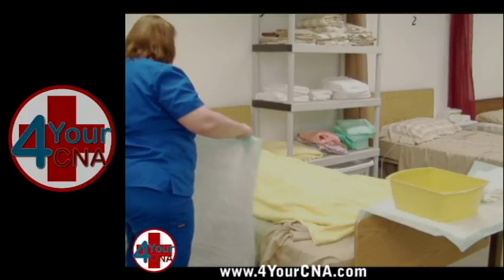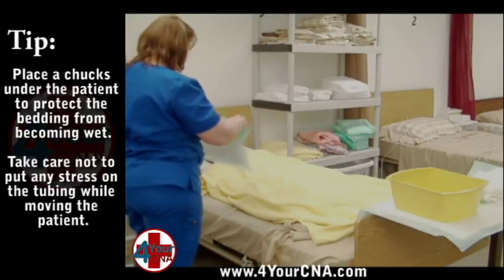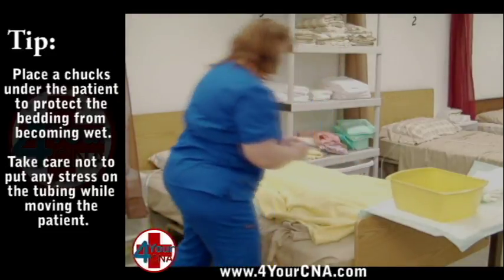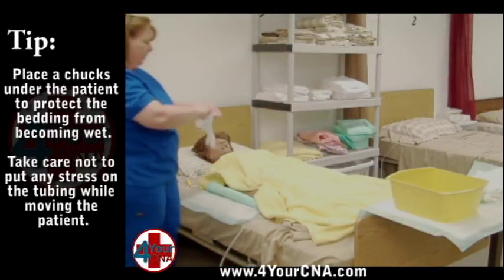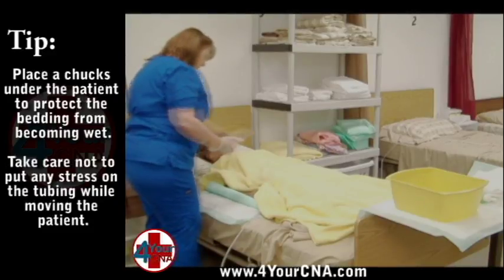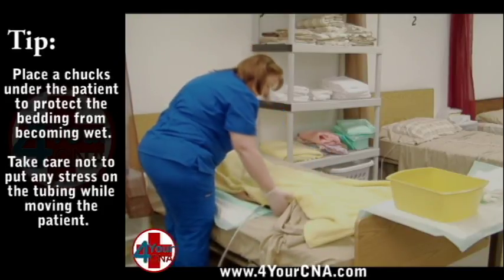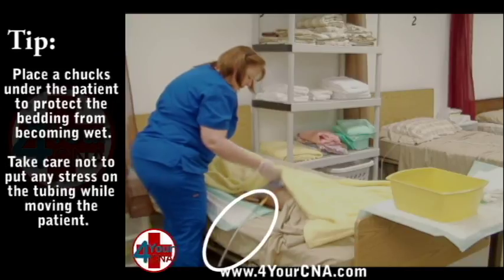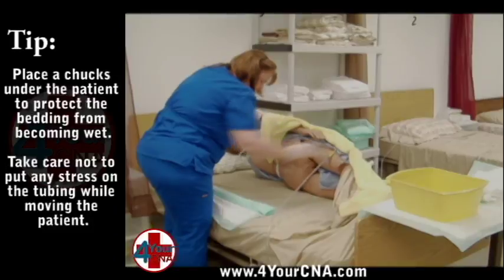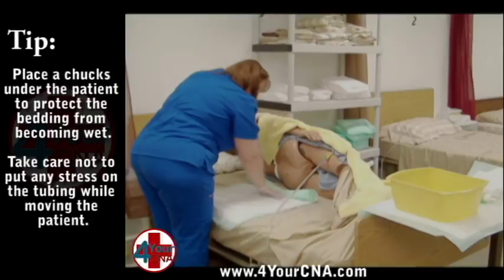Open a chucks and hold it with the plastic side facing away from you. Roll the chucks toward you about three quarters of the way down. Place the chucks on the mattress beside the patient. Apply your gloves. We will be placing a chucks underneath the patient while we clean in order to keep the bed from getting wet. Assist the patient to scoot her body toward you so she is lying on her back near the edge of the bed. Verify where the catheter and tubing are so you do not pull on them as you turn the patient.